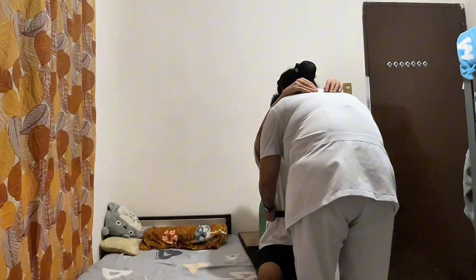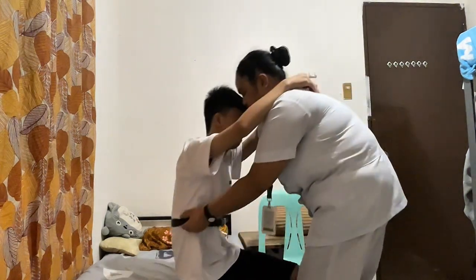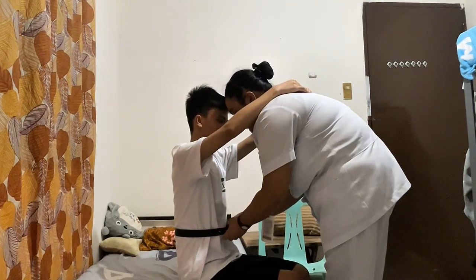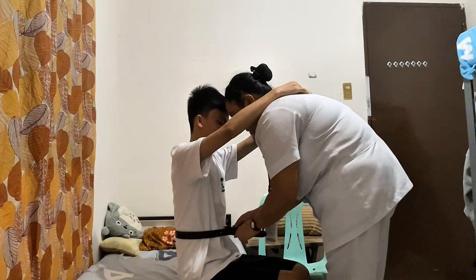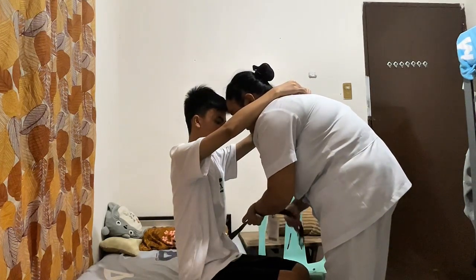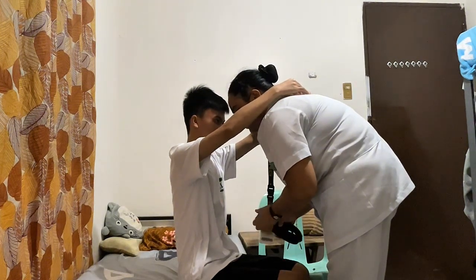Then move the patient carefully from chair to bed. Then unbuckle the transferring belt. Then I will ask the patient to remove his arms from my back.